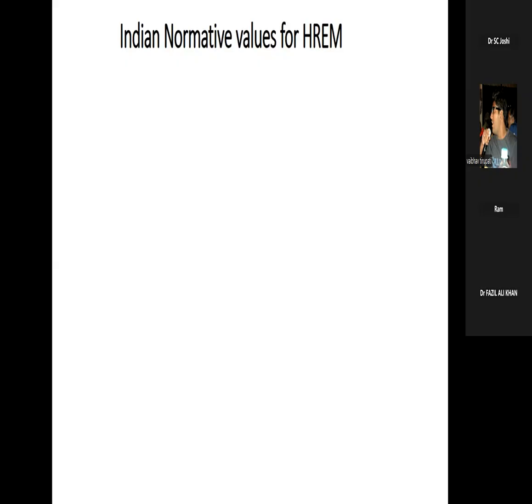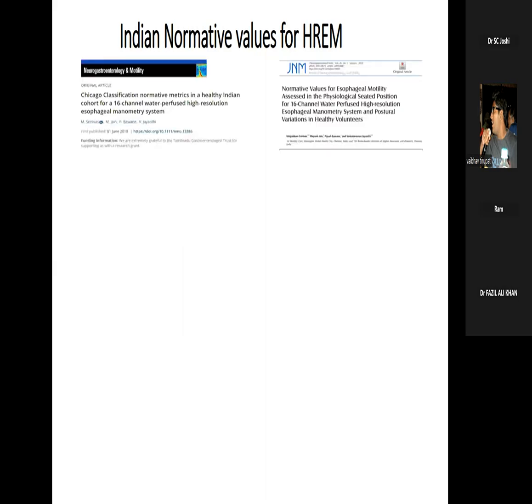So we do have Indian normative values for high resolution manometry, and this is something that I take pride in telling. I was in the UK for 13 years and had never done manometry there. When I came back and joined Global Hospital, my chairman told me that I had to take this up. I started learning gradually. Then I saw we are using the Chicago classification and applying all those values, but that is solid state. We do not have normal values. I used to keep asking Narayan, what is going on? He said, no, sir, nobody has done it. So then I decided to do normal values.